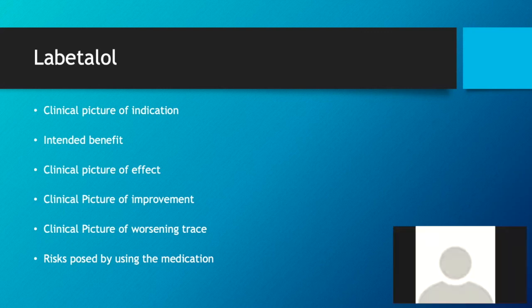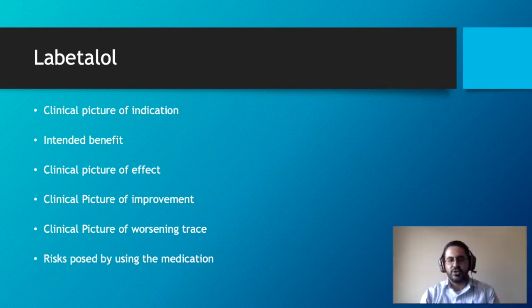They'll still be there as well. They should still be there because decelerations are parasympathetic and we're not blocking the parasympathetic. So we're going to end up with a baby that has a lower baseline and reduced variability. You can wake it up, you can stimulate it, so it can accelerate if you stimulate it, and it can decelerate if there are cord compressions or any hypoxic events.